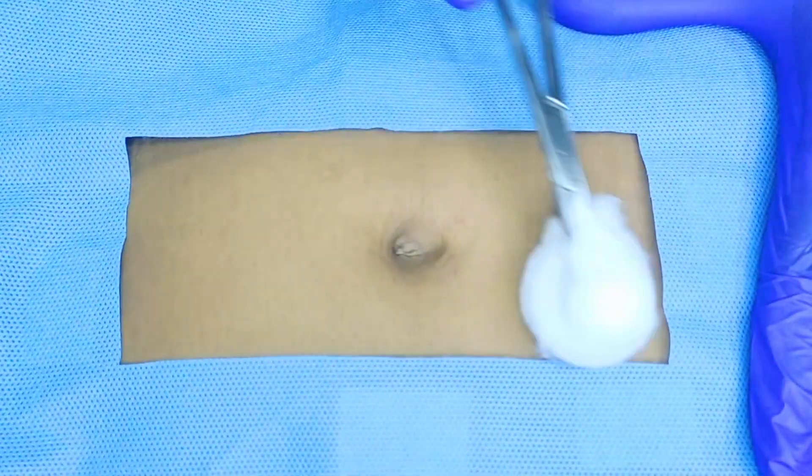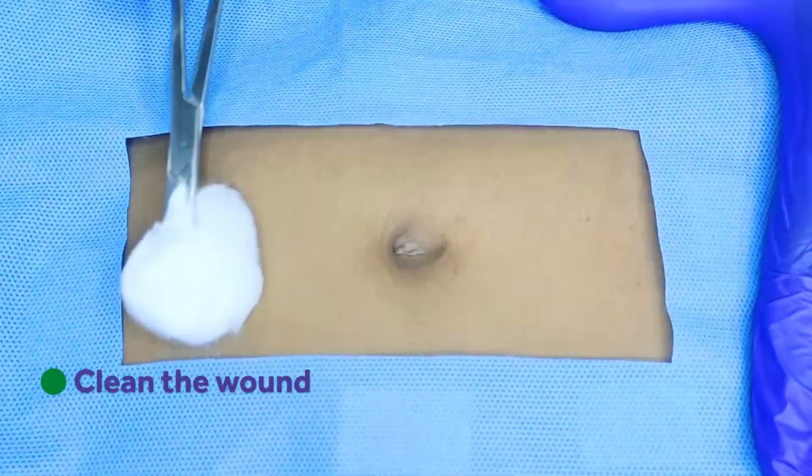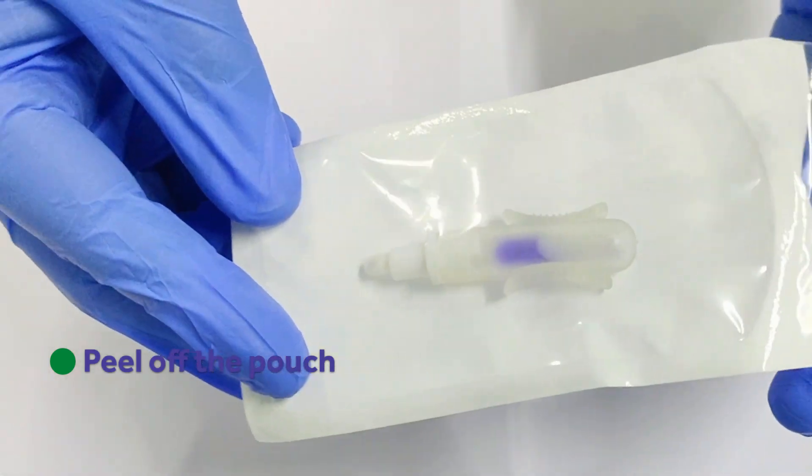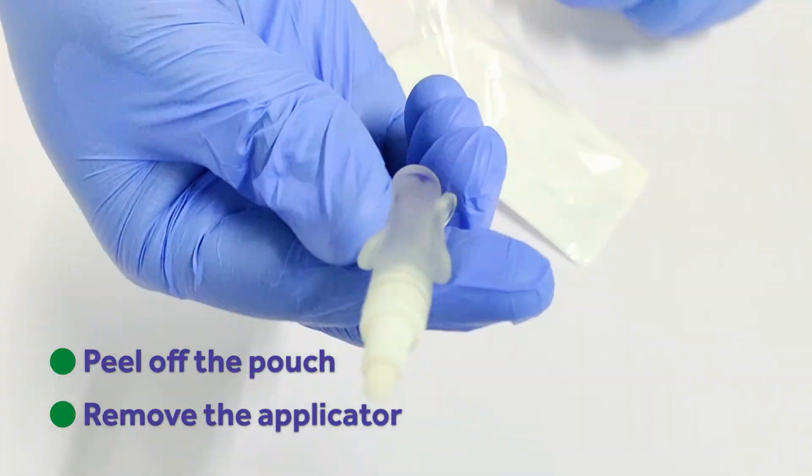It is quick and easy to apply the skin glue. First clean the wound and allow to dry. Peel off the sterile Quick Fix skin glue pouch and remove the ergonomically designed applicator.